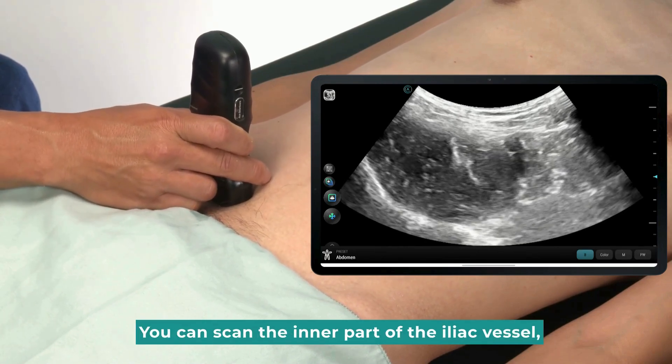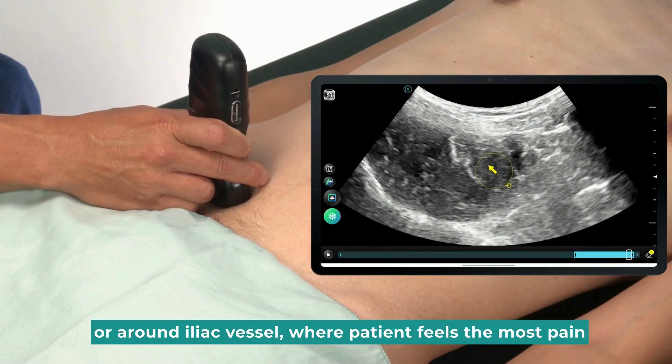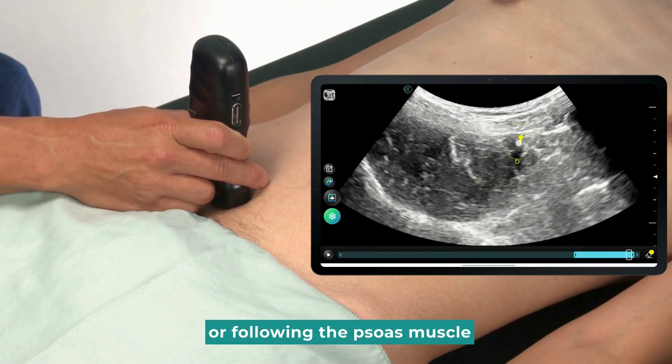You can scan the inner part of the iliac vessel, or around the iliac vessel where the patient feels the most pain, or following the psoas muscle.